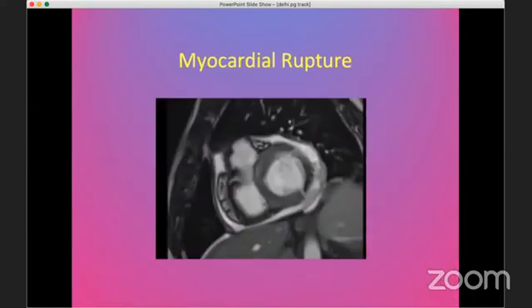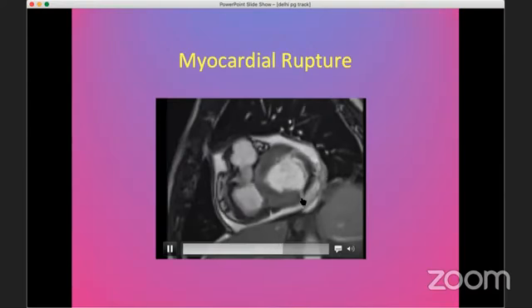And this is a very interesting patient who was successfully stented in the LAD and developed pain 2 days later. We took him up for an MR, and when we did the cine and the perfusion, this is what we saw.